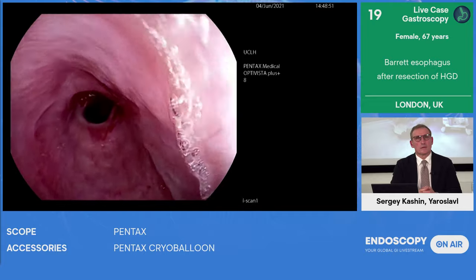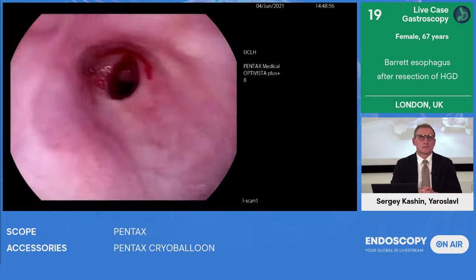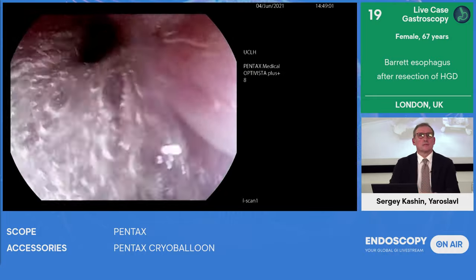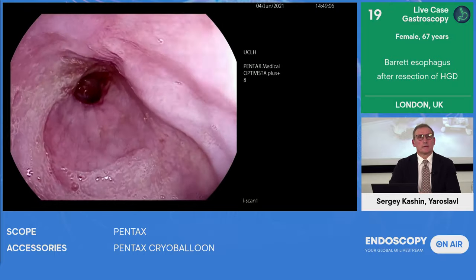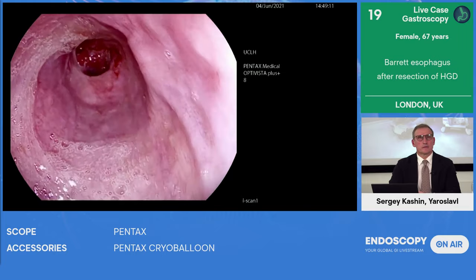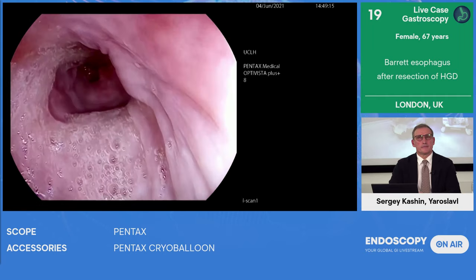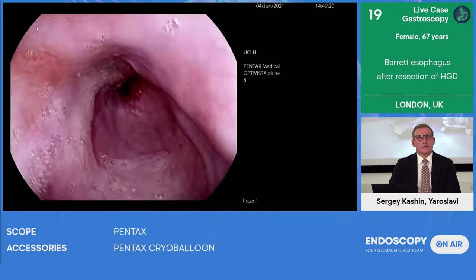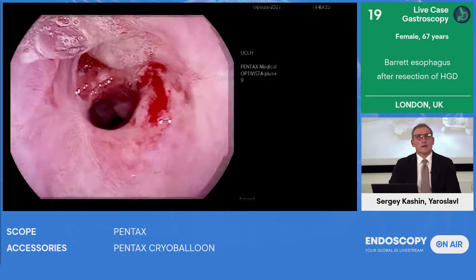But just to summarize: nice endoscope, good imaging, great access through the working channel, and a big step forward for the balloon in terms of the ability to treat difficult anatomies like this, but also to streamline your treatment. Being able to see where your spray is going to come out, anticipate where you're going to be able to treat and plan your treatment is much, much better with the second generation device. And hopefully the clinical outcomes will follow, Sergey. Rehan, thank you so much.